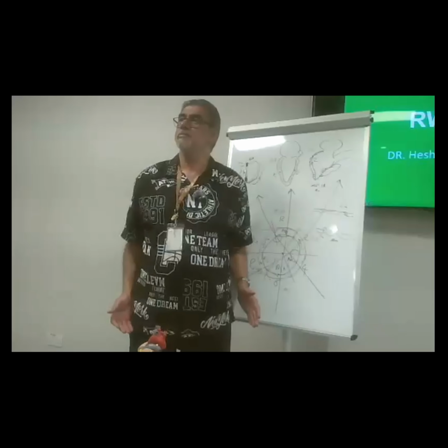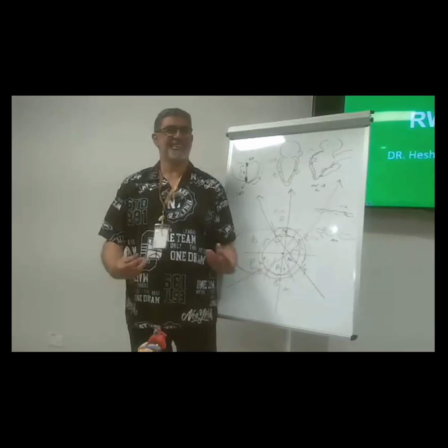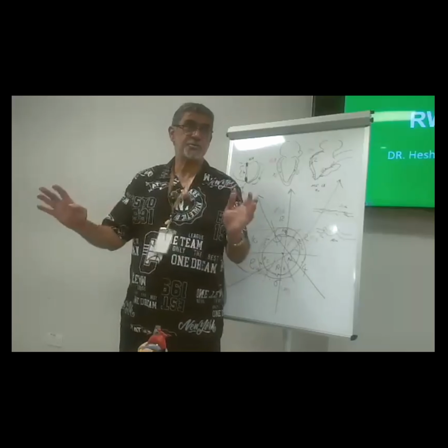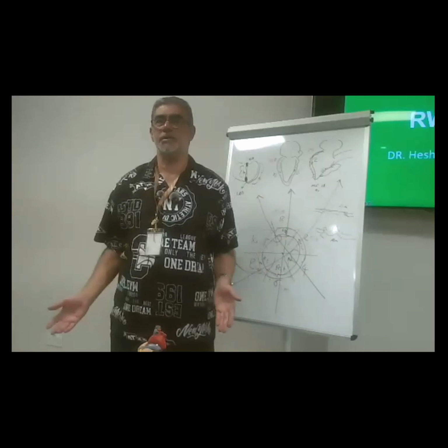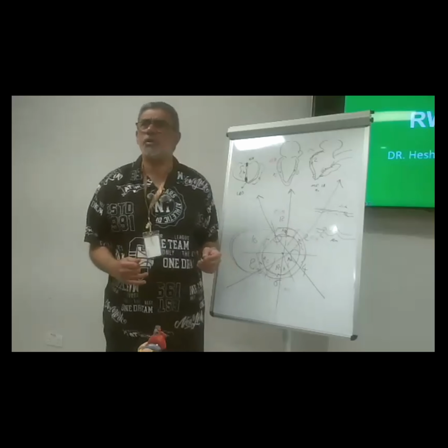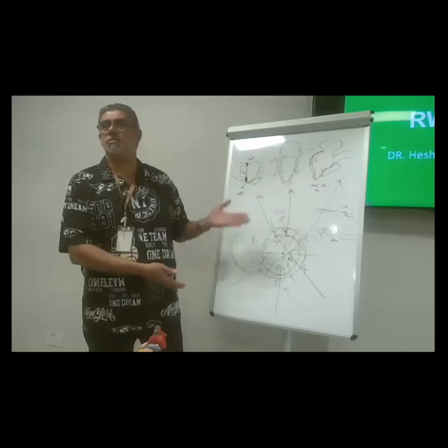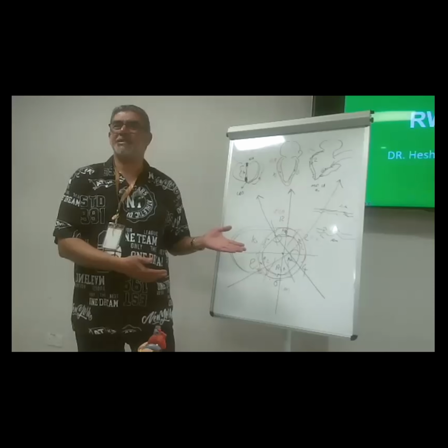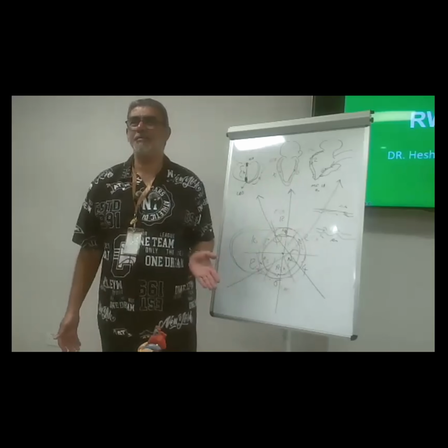All of us are interested in ejection fraction. Okay, this is true. Nobody can ignore this. We are doing this in our practice. No one asks, what about the regionality? Who is hypokinetic? Who is akinetic? So why are we doing this? So what is the benefit of this again?